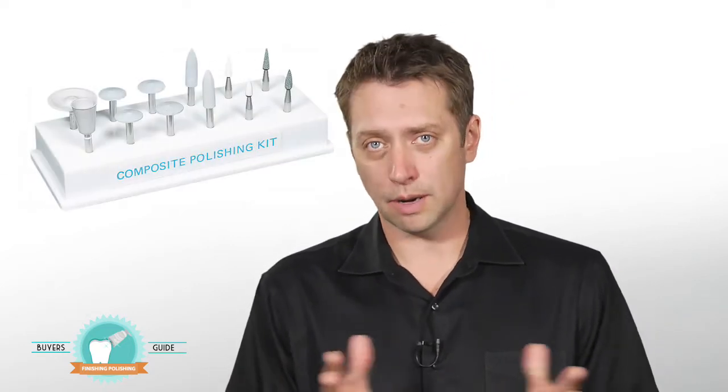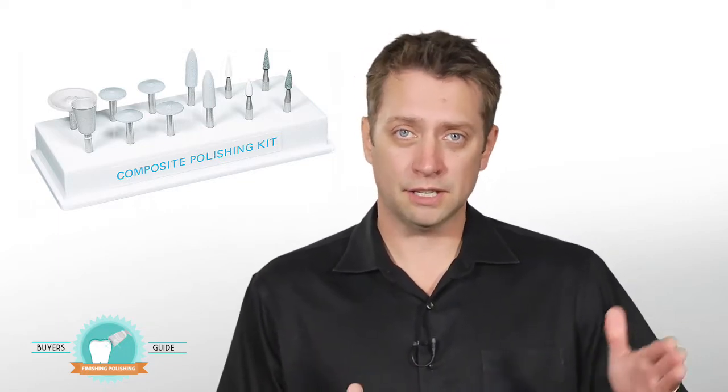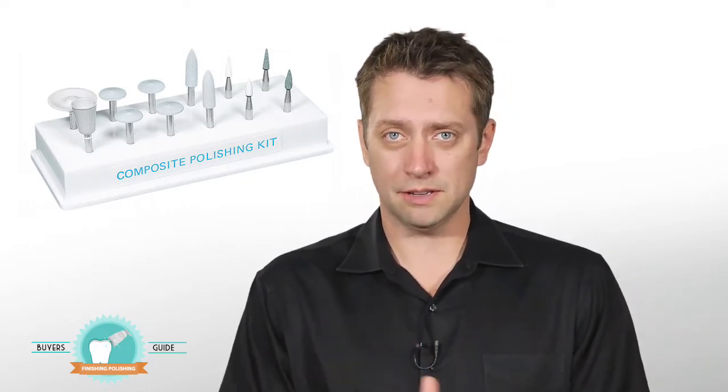When you're picking a system, one of the things to understand is the entire sequence. You need to really understand where you're starting and where you're ending, whether it's stones or rubber points or strips. Know and understand that sequence, and you need to follow that pretty closely so that you can get to that perfect end result. Now, when you're thinking about that sequence, I also want to use something that is simple. Maybe there's 2 steps or 3 steps at the most. It makes it a lot easier to use and it's more efficient, especially when you're polishing in the mouth.